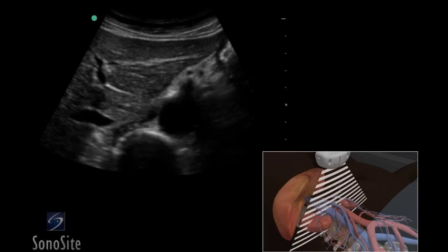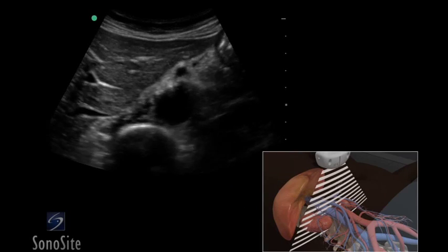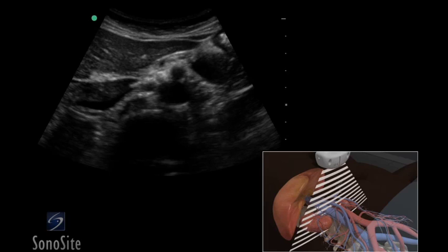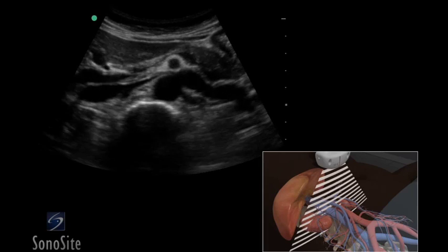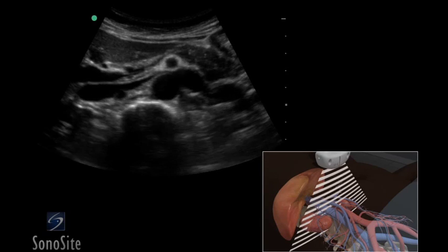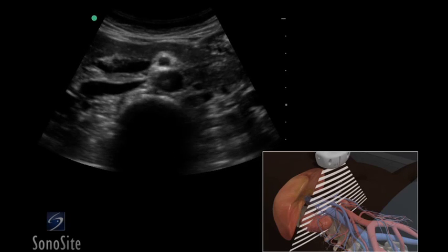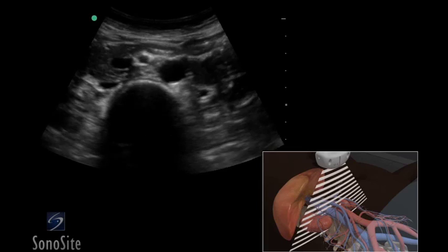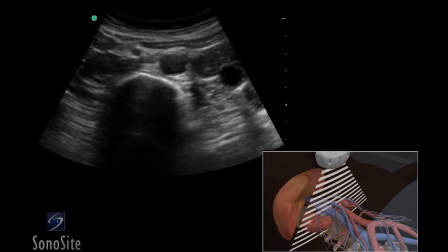A curved or phased array transducer with an abdomen exam type is used to perform an aorta ultrasound exam. The entire length of the aorta from the level of the diaphragm to the bifurcation of the iliac arteries must be evaluated in two planes.